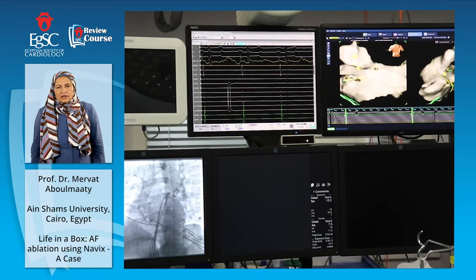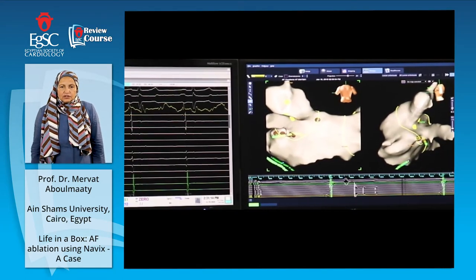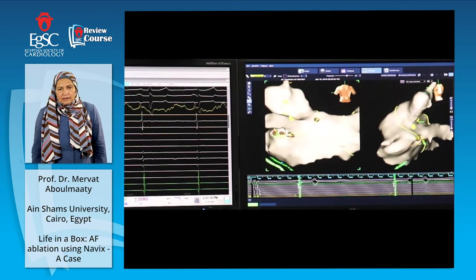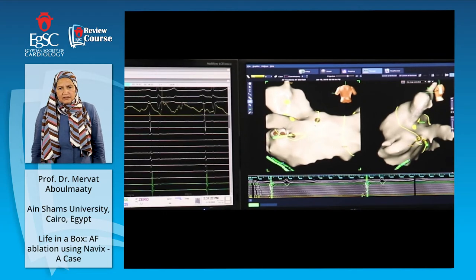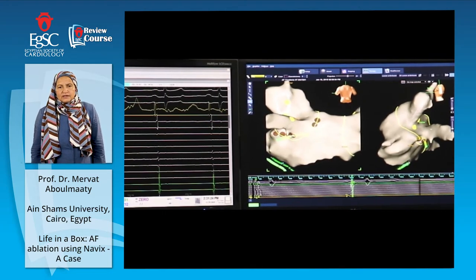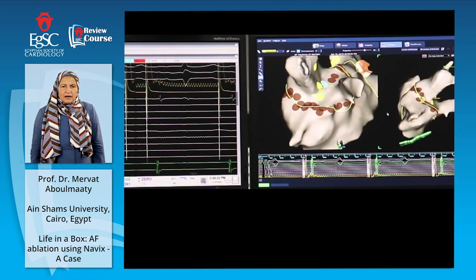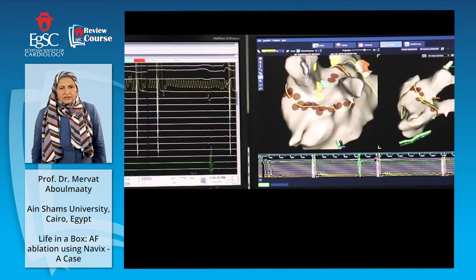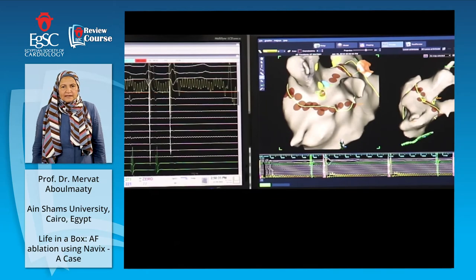We start the ablation. The ablation points are the brown ones. We deliver energy 40 watts anterior and 35 watts posterior. Some centers do temperature probe monitoring. Here we go point by point, as you can see, for 20, 30, 40 seconds, according to the operator. And then we check for the potentials, and then we pace from the circular catheter for exit block.